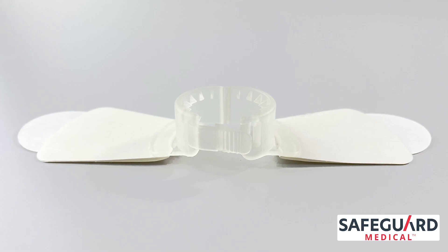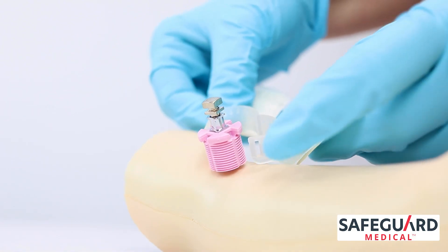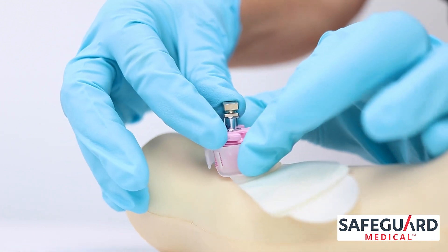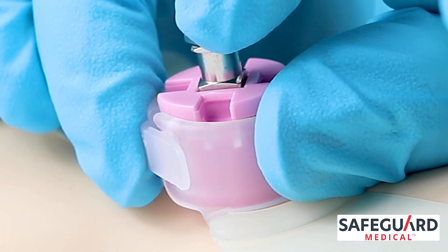Use the NeoInfant fixation dressing to affix the stabilizer base to the limb. Position the fixation ring around the stabilizer base and lower it onto the skin. Lock the ring by squeezing its sides together until the clasp clicks shut.